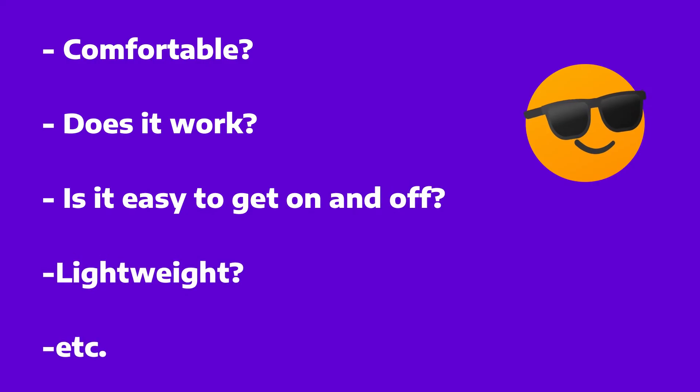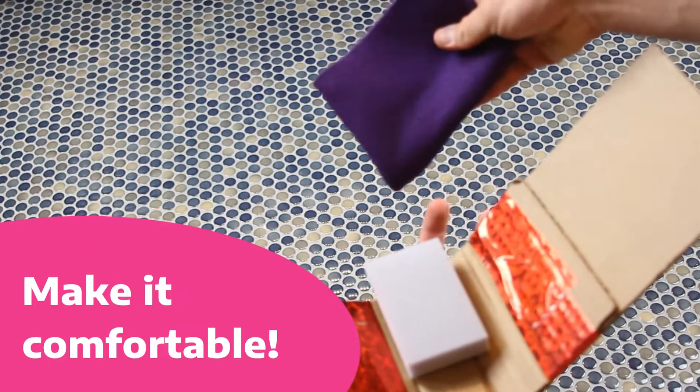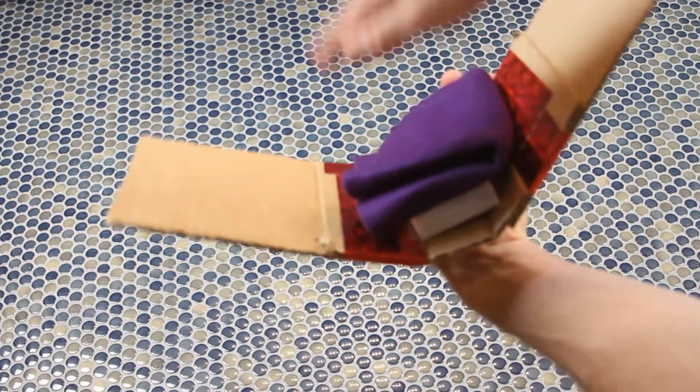Speaking of being comfortable, we wanted to take the sponge and a piece of felt to make a nice soft spot that our knee can rest on.